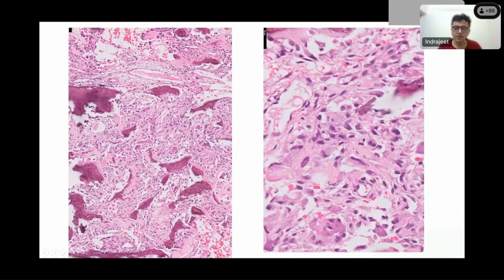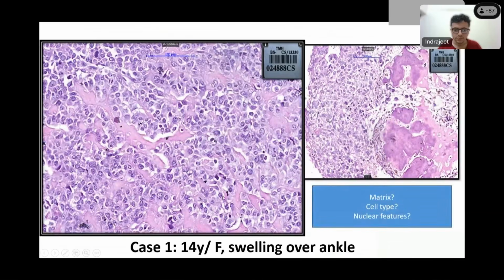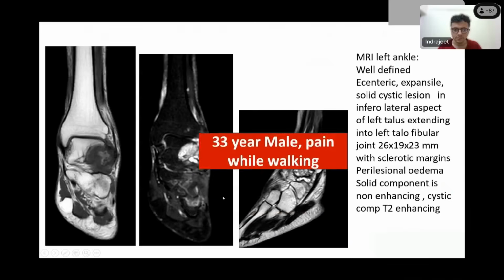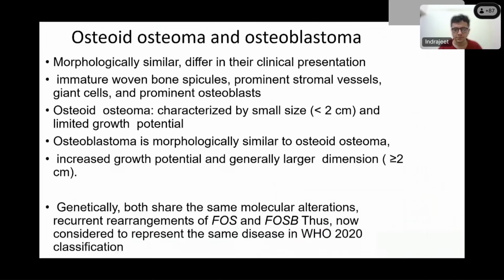the diagnosis. And if you compare this image, for example, do these lesional cells match the atypia of that osteosarcoma? No, they are much lower grade. Then we discuss with imaging again, and then we arrive at the diagnosis of osteoblastoma. Let me tell you, this is a very difficult situation, not as easy as it sounds here in this meeting. Very difficult clinical scenario.